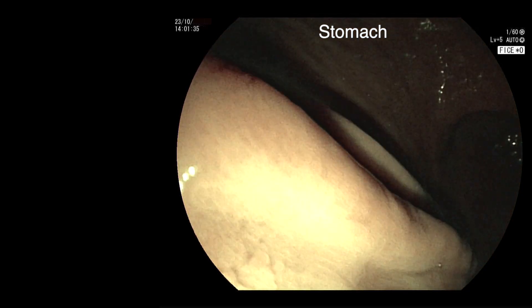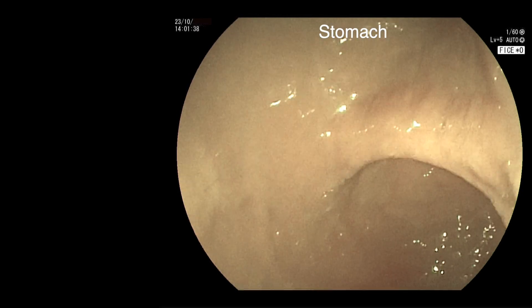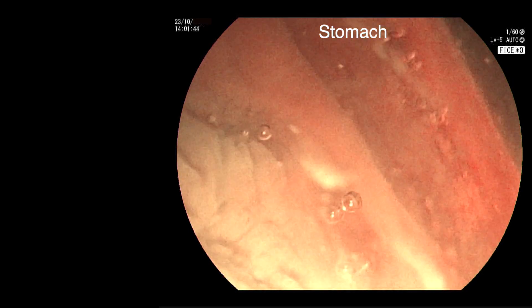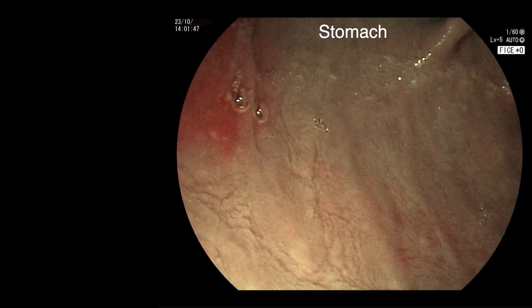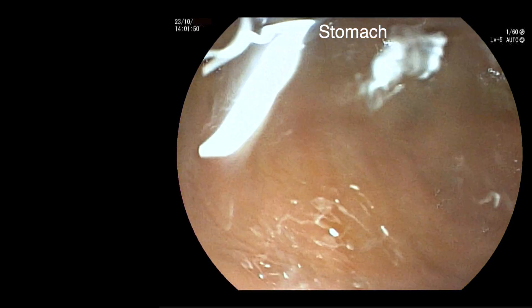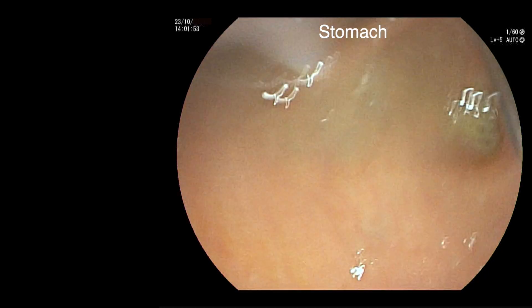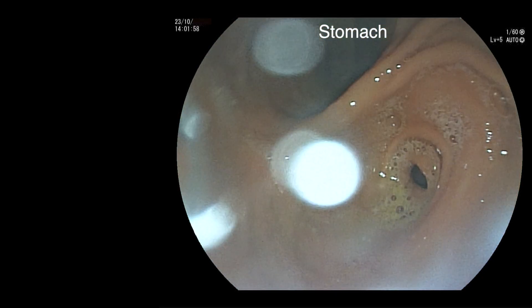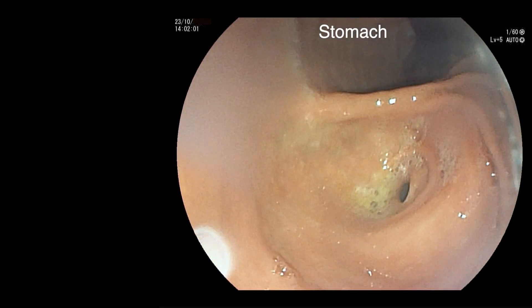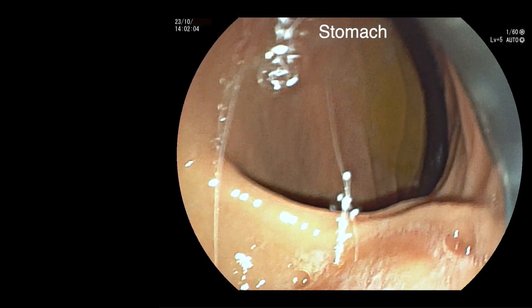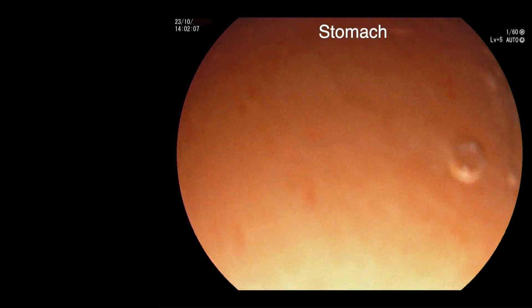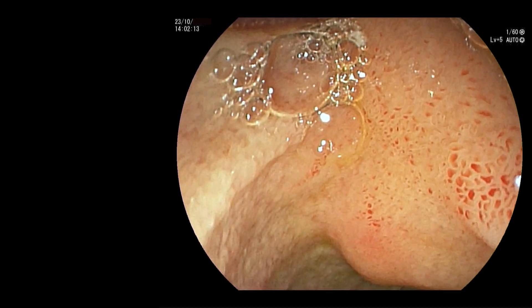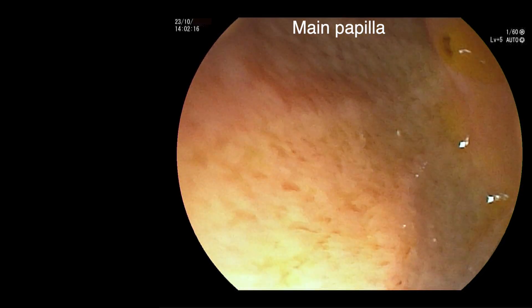The scope goes down surprisingly easily and we find ourselves in the stomach. There is no obvious big bulge of the stomach wall. The scope is then passed through the pylorus and the papilla is found easily in the second part of the duodenum. Bile can be seen flowing from the papillary orifice.